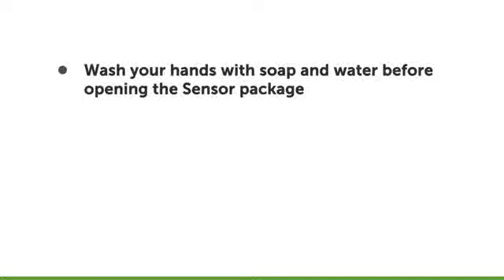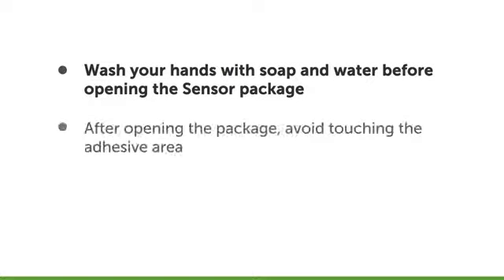First, wash your hands with soap and water before opening the sensor package. After opening the package, avoid touching the adhesive area.